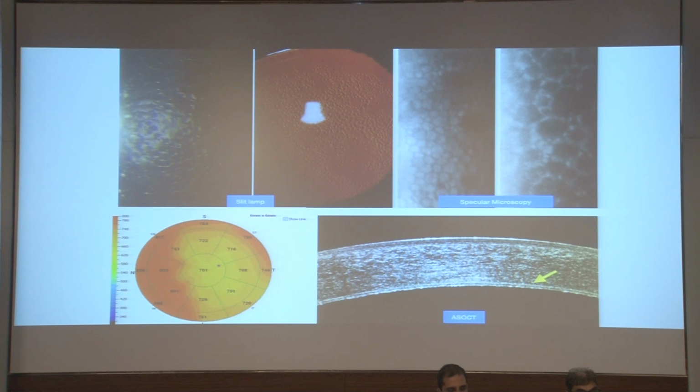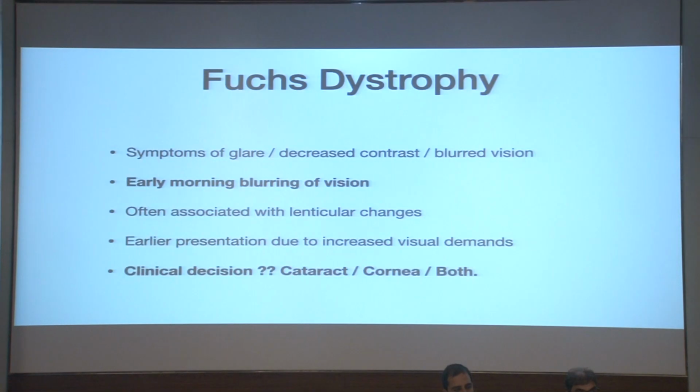Specular microscopy shows you the dark areas. And if you have anterior segment OCT, you will see an increased central corneal thickness. The Descemet's membrane will also look double layered, duplicated, bright and highly reflective, and you can see those bright specks on the endothelium.